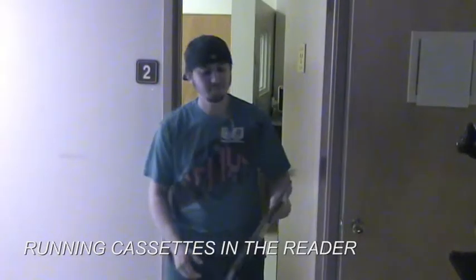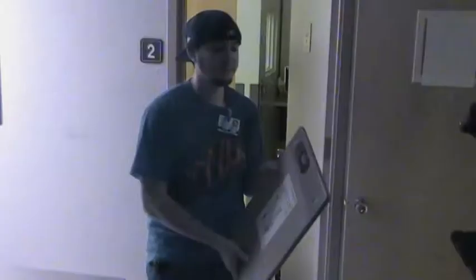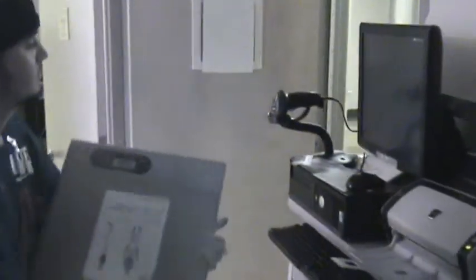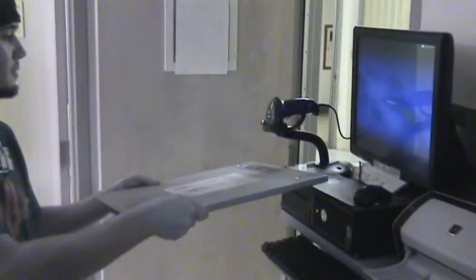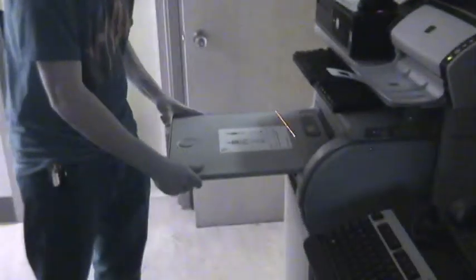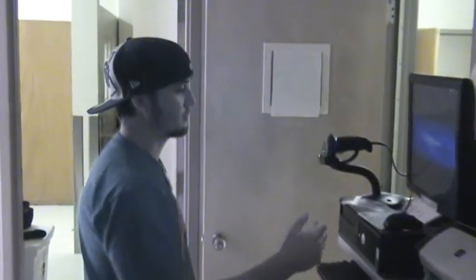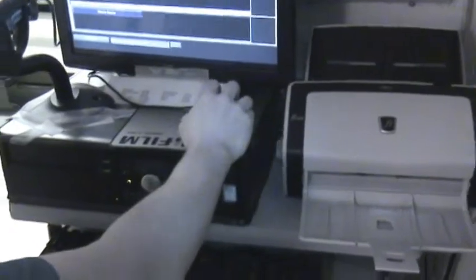Now after each exam that is completed, we will bring the cassette over to the reader. We will find the barcode in back of each cassette and scan the cassette. Then, once we hear the beep, we will put the cassette inside the reader. Then the reader will bring the image up on the monitor. Then from there, we critique.